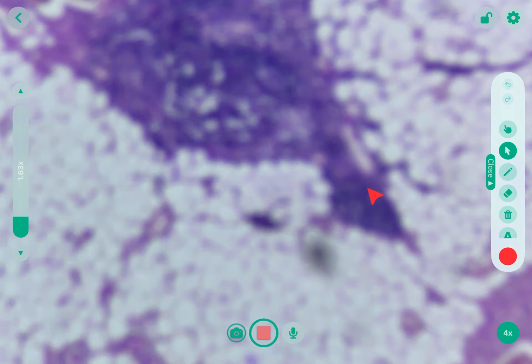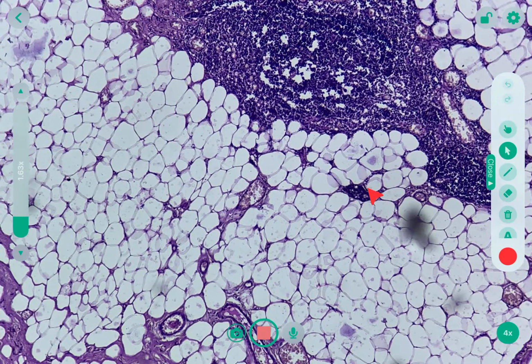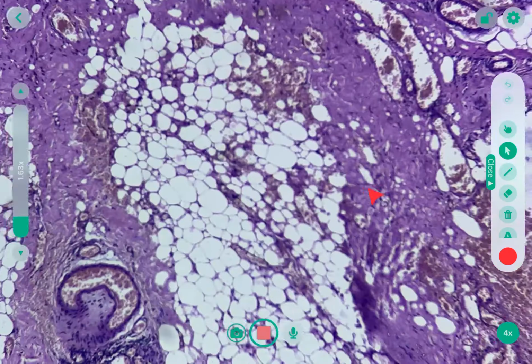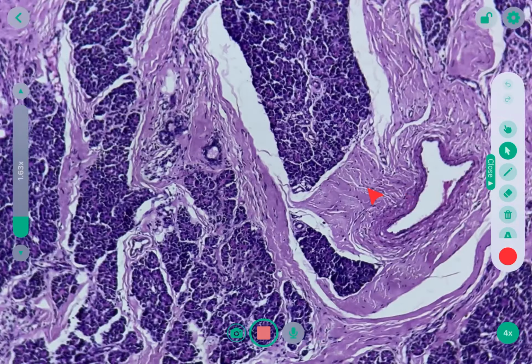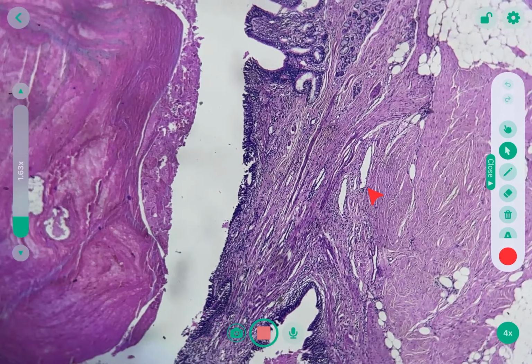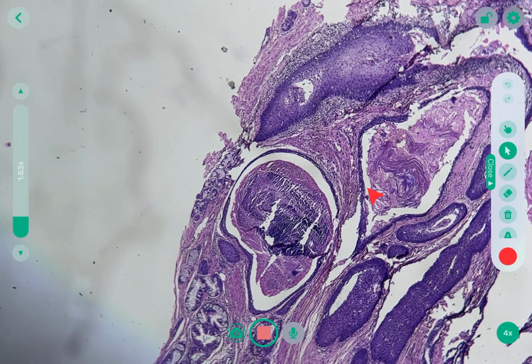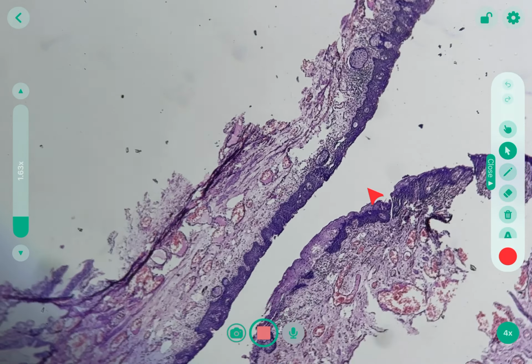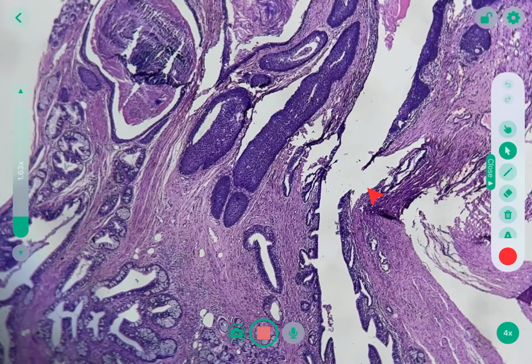Then here we can appreciate these lymphoid aggregates. So this may be the adjacent thymus or the remnant of thymus, which is situated also in the anterior mediastinum. Again we can appreciate the different components, mucin-secreting cells with respiratory-like epithelium, with stratified squamous epithelium. Here we can appreciate this keratin cyst, this pilosebaceous unit, beautiful stratified squamous epithelium, which is also continuous with this pilosebaceous unit and keratin debris.